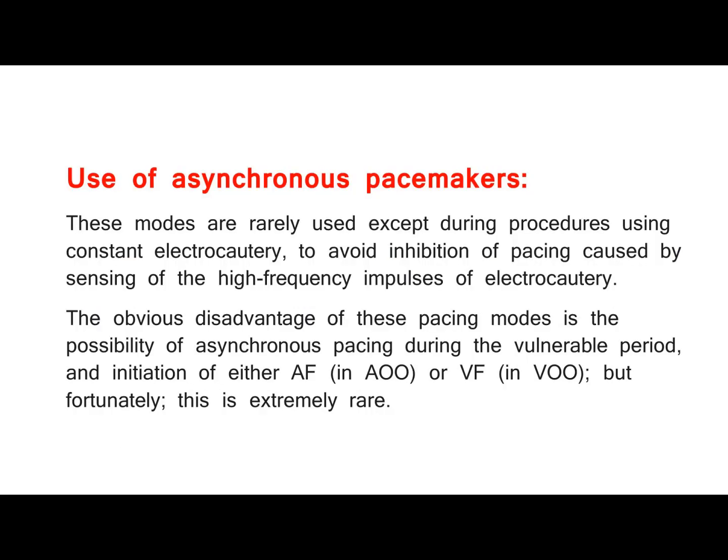Use of asynchronous pacemakers. These modes are rarely used except during procedures using constant electrocautery, to avoid inhibition of pacing caused by sensing of the high-frequency impulses of electrocautery. The obvious disadvantage of these pacing modes is the possibility of asynchronous pacing during the vulnerable period, and initiation of either AF, in AOO, or VF, in VOO, but fortunately, this is extremely rare.